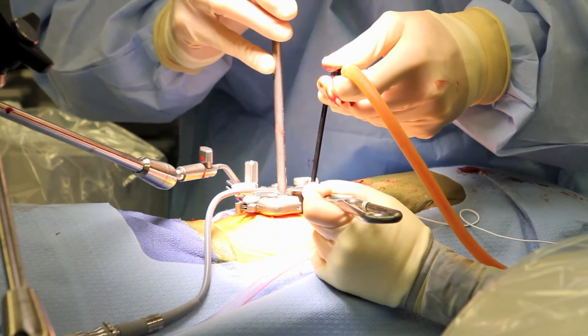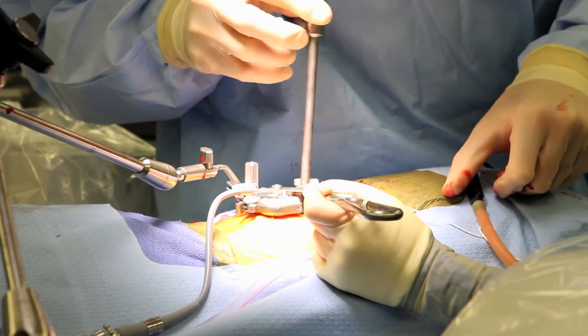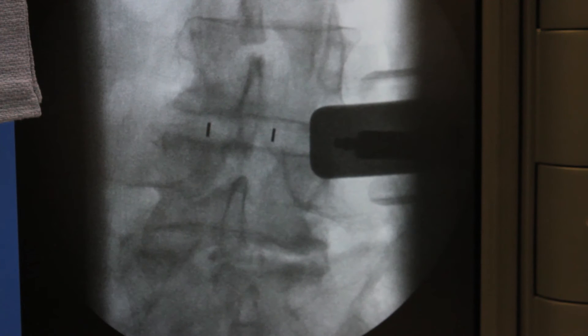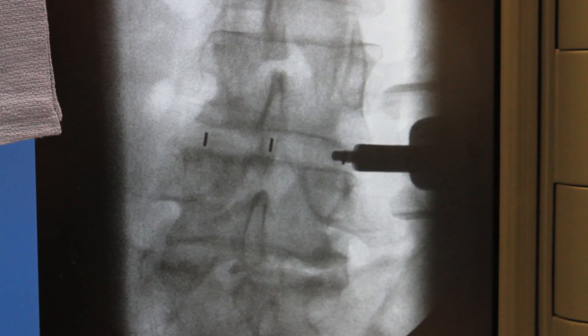The cage is then placed into the disc space for minimally invasive lateral fusion. Intraoperative fluoroscopy confirms distraction of the disc space and proper positioning of the cage within the disc space.